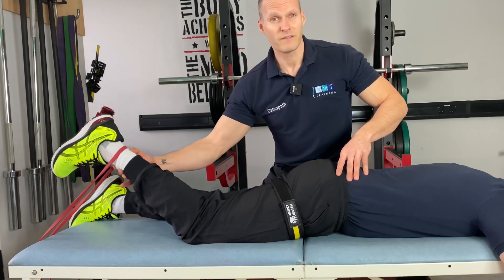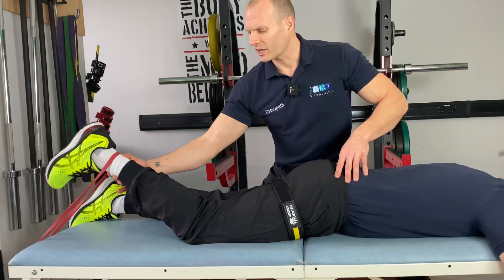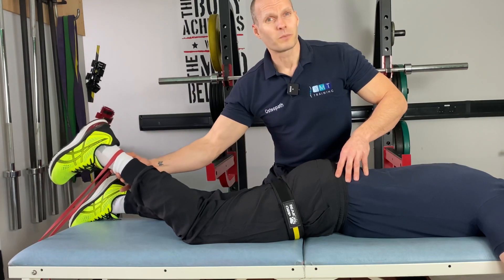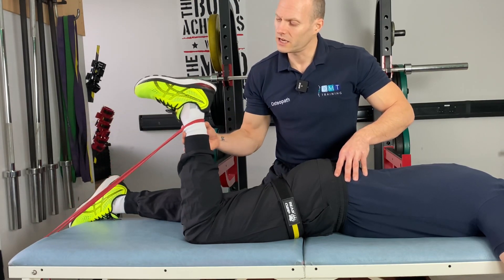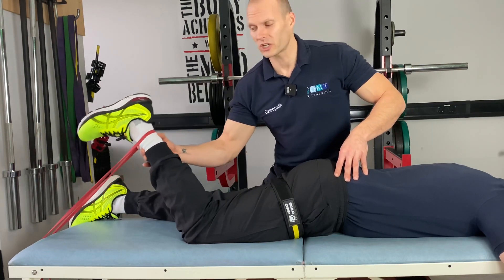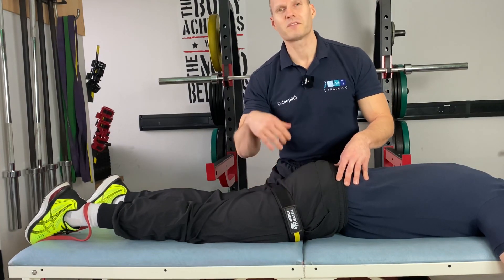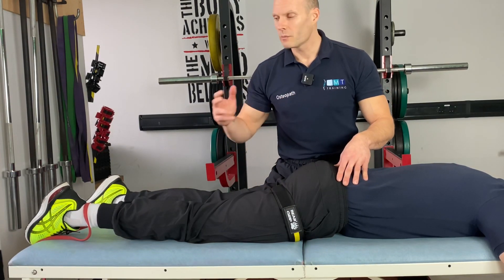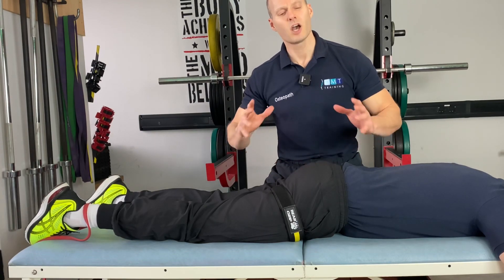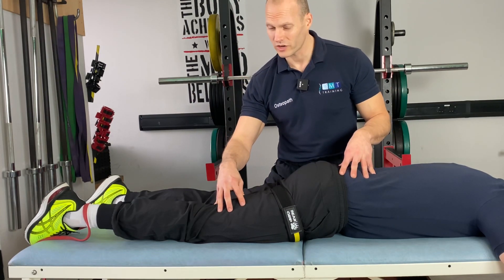We can go through our protocols — either 30, 15, 15, 15 — or be guided by the patient and go through sets of 10 to 20, seeing how they get on. Remember to give the patient a 30 to 60 second break between each set. At the end of the session, take the occlusion off the limb and give the patient two to three minutes of rest before moving on to your next rehab exercise.